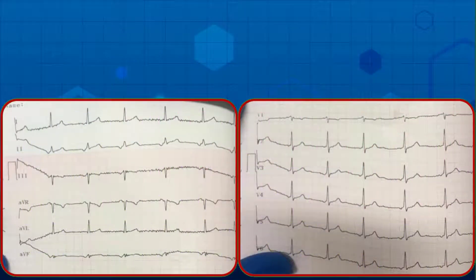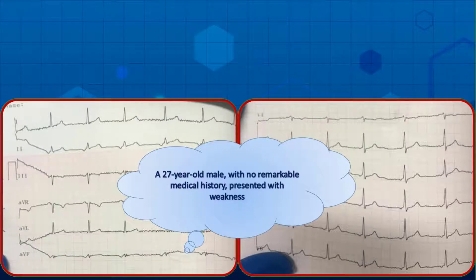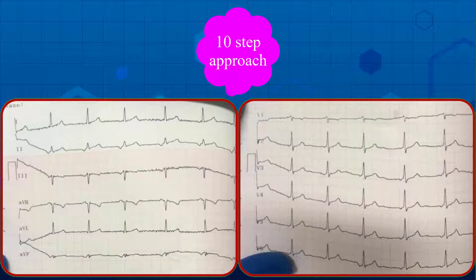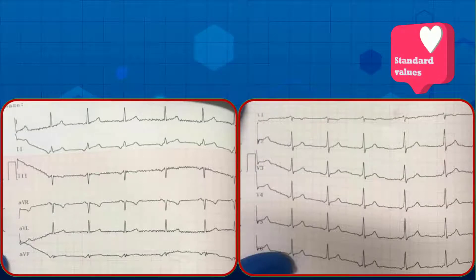This EKG is taken from a 27-year-old male with no remarkable medical history who presents with weakness. The physical examination is completely normal, and an EKG is obtained. What do you think about the strip? Does it need any medical intervention? As usual, to interpret an EKG properly, apply the 10-step approach.